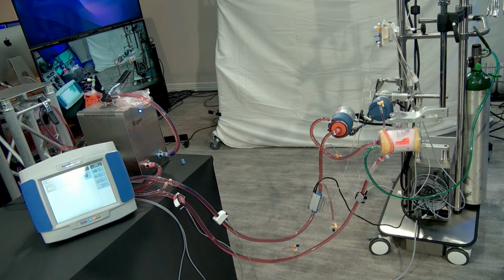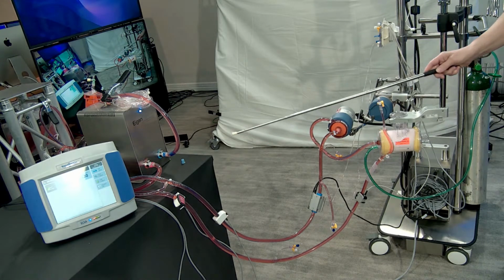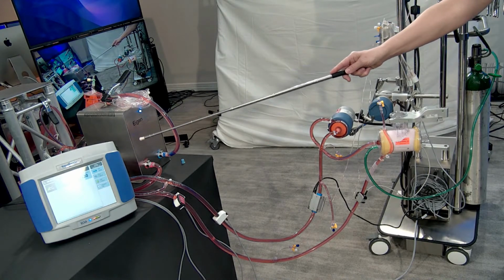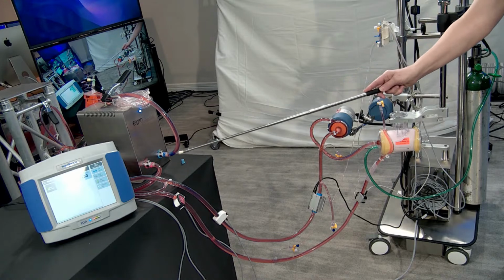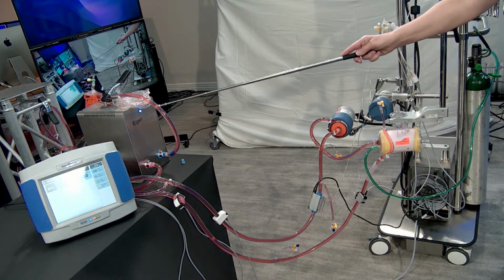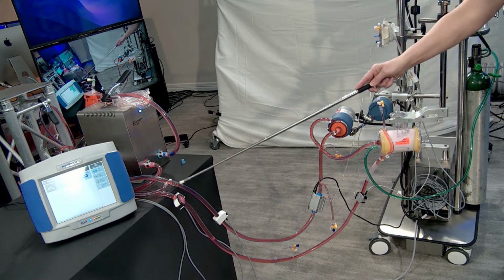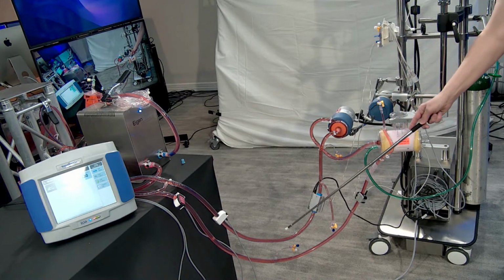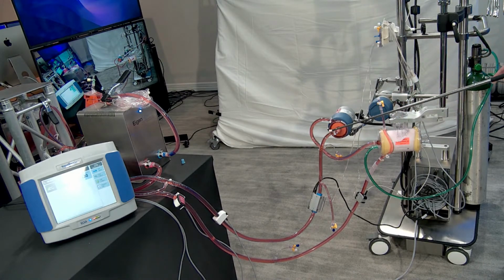Okay, everyone. Starting over here, this is the eigenflow simulator. This would be the drainage from the patient, wrapping around, coming down our access line and up into our centrifugal pump.